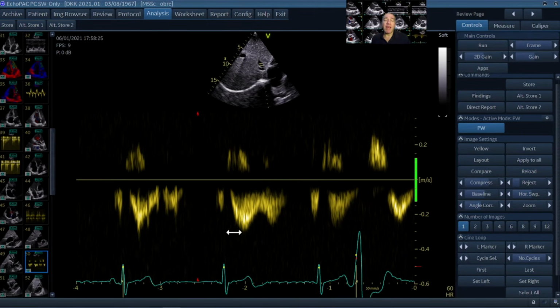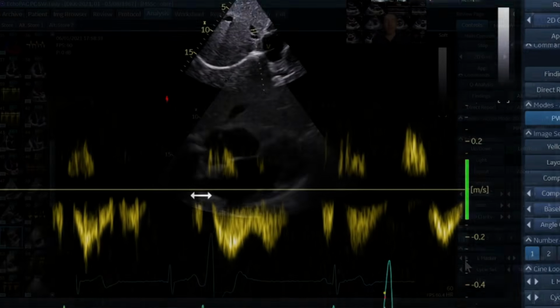If you have a less healthy person with right ventricular hypertension or with more significant tricuspid regurgitation, then you would notice a very significant systolic backflow due to the high pressure, due to the high afterload, and this can be very nicely picked up by this liver vein Doppler, which should be part of every exam where you see a clear pathology on the right side.